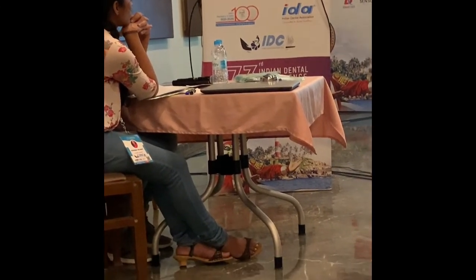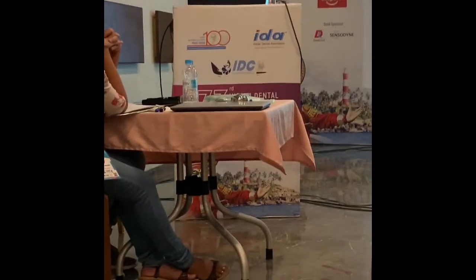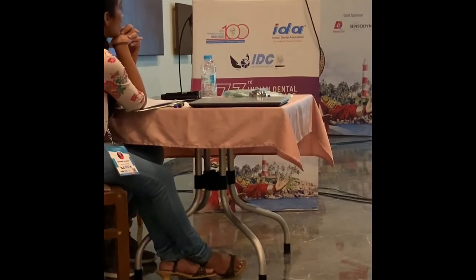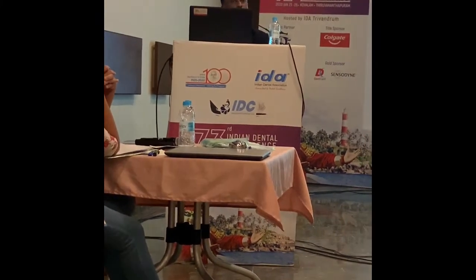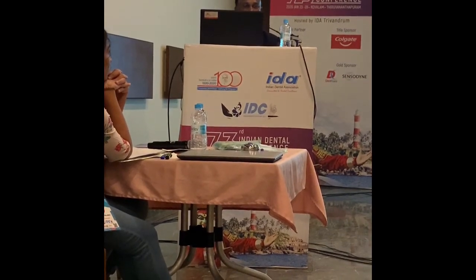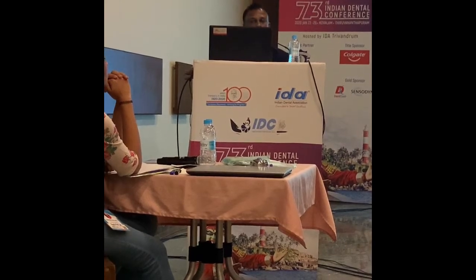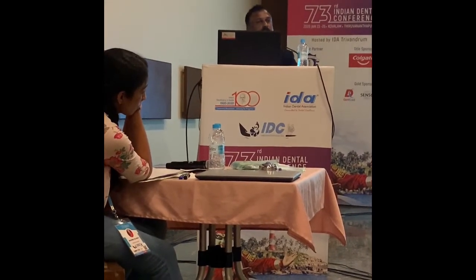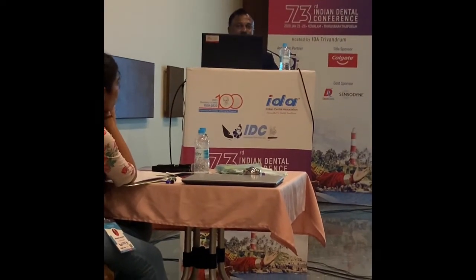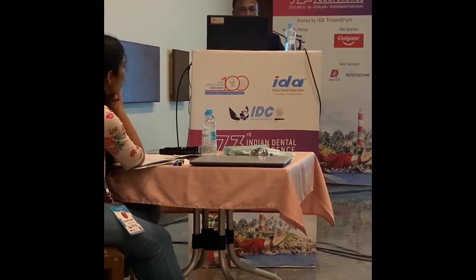So this is one interesting patient of mine, an 86-year-old patient with severe cardiac issues as well, who had lost all his teeth, and his last wish was to have a complete set of teeth. He was very, very adamant on it. He wanted fixed teeth. So that is one of the post-op pictures. What we did is we went for the all-on-4 technique. Of course, it was done by my wife only. I check in whenever there's a problem. And then all these four implants were placed in the mandibular anterior region.